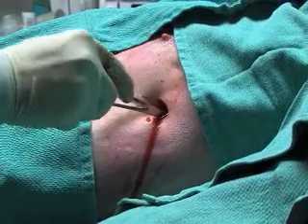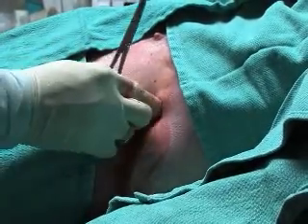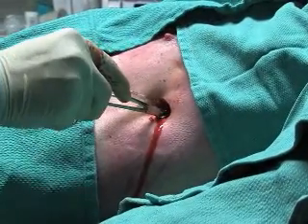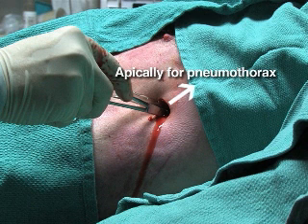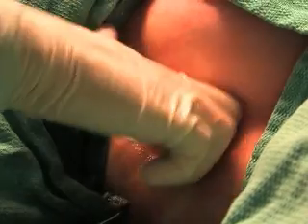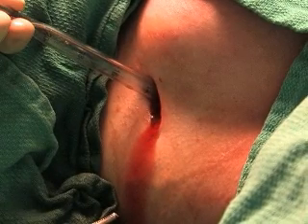Pass the tube through the incision, unclamp the jaws of the Kelly, and direct the tube through the tract slowly using your finger as a guide. If the tube is meant to evacuate a pneumothorax, aim it apically towards the top of the lung. If the indication is to drain fluid, aim it basally towards the bottom of the lung. Make note of the depth the tube has passed by keeping track of the numerical markings on the side of the tube.